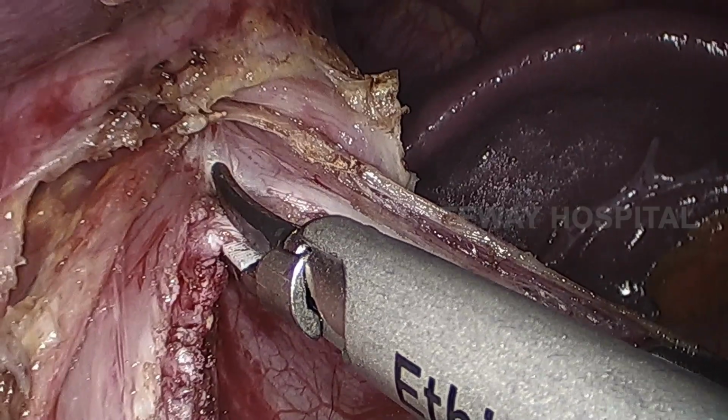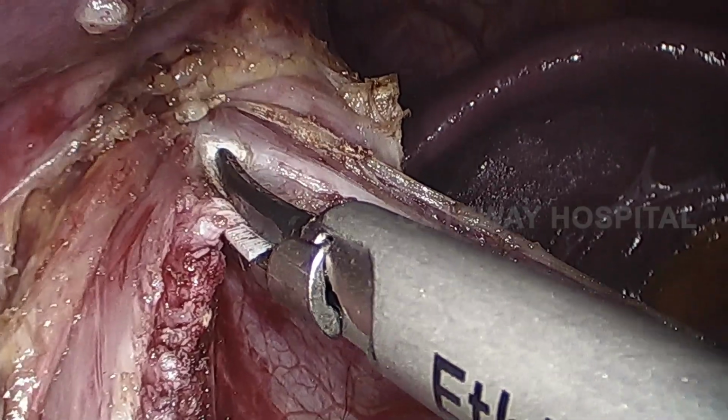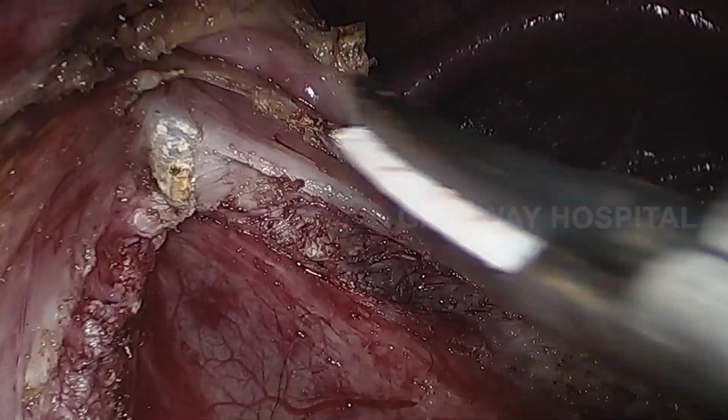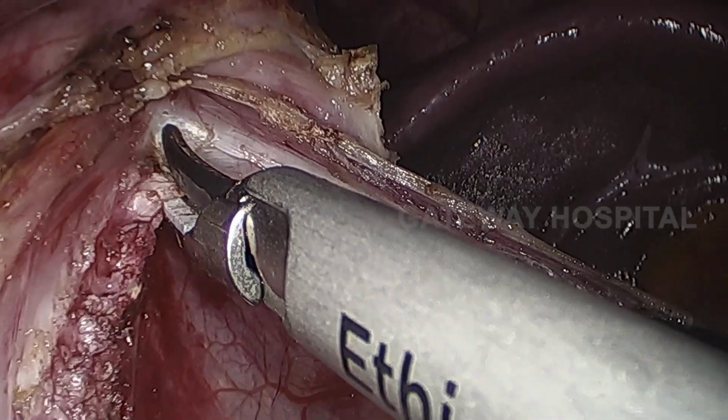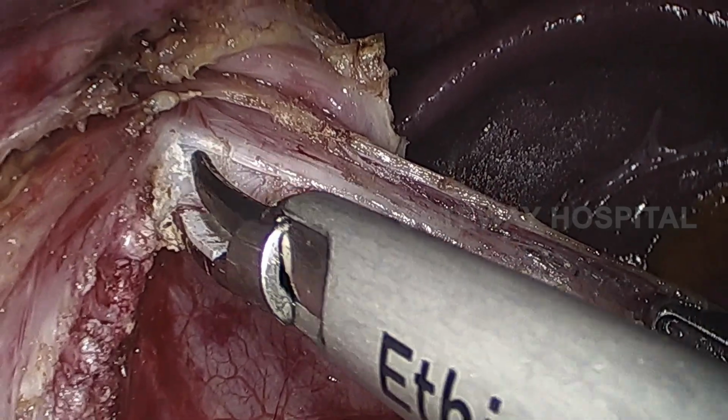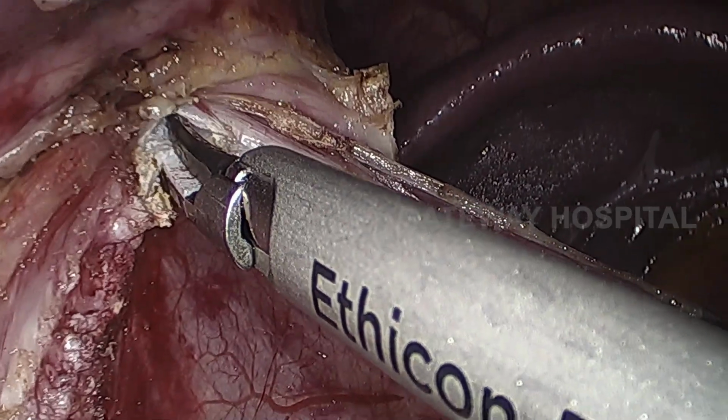You can also appreciate the anterior vagus close to the tip of the harmonic shears. If you mobilize the esophagus nicely into the mediastinum, you can extend the myotomy further cranially.